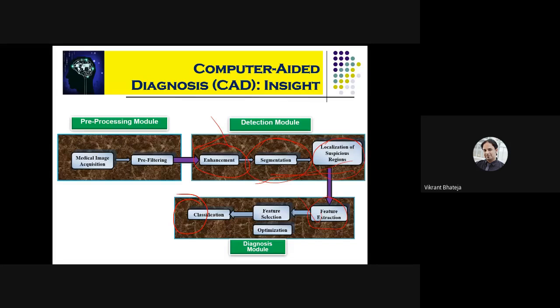Another part is that people try to explore the available set of feature extraction techniques or the feature extraction tools. But the point is, you would have already learned that feature extraction tools are nothing else but small parameters, or rather statistical parameters, which you are extracting from your region of interest.